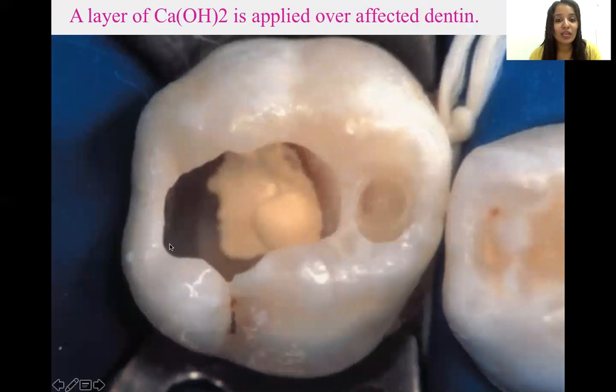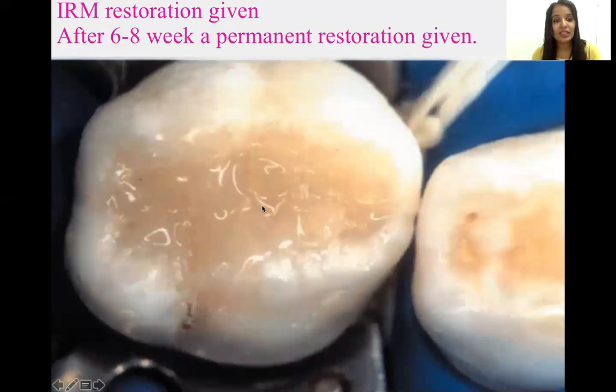Then a layer of calcium hydroxide is applied over the affected dentin area, as you can see in the picture. Then an interim restoration, IRM restoration, is given. After 6 to 8 weeks, a permanent restoration can be given in indirect pulp capping treatments. There are two concepts: one says that we can complete the whole procedure in the first setting itself, and the second school of thought is that we should complete the procedure in two appointments.